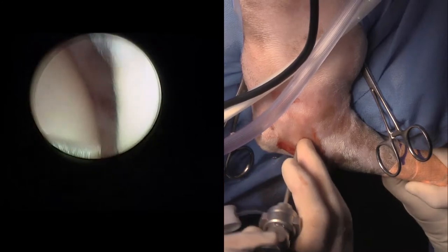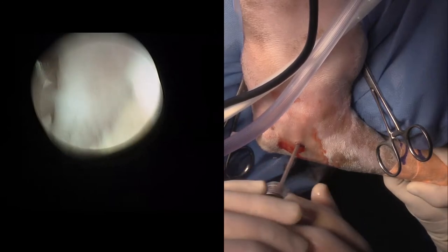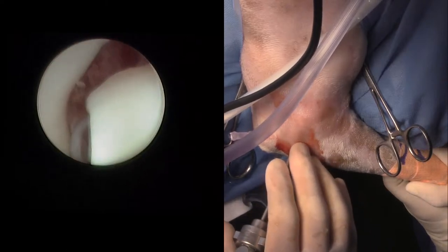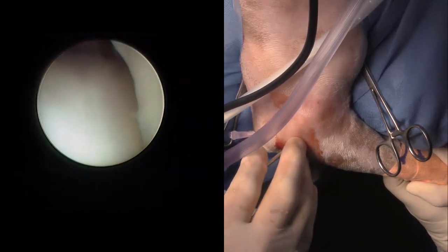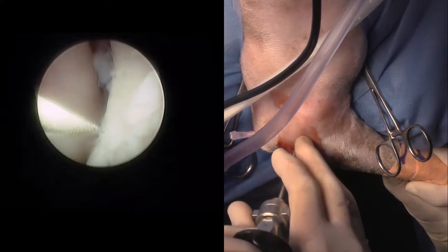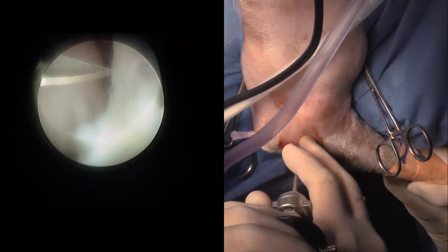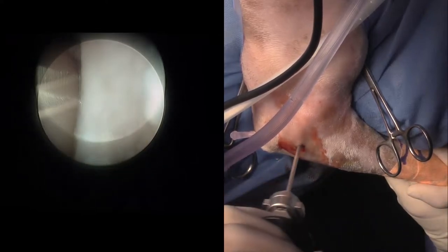This scope may be broken. Just having a look around in here. So that's the humeral condyle there, and that's the big fragment sitting right there. So that's the coronoid right there. I'm sorry that it's so blurry. I'm concerned that maybe our telescope is broken. I'm glad you went first.